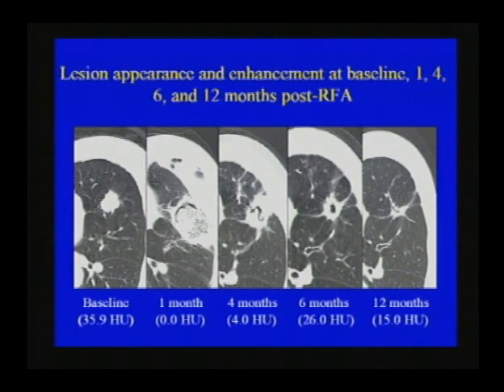I have to tell you that the very first case we did, we scanned the patient the very next day. And I have to recommend very strongly that you never do that. Because if you do that, what you will see is a complete whiteout of the lung, huge collections, and you will be tempted to do as I did, feeling that I had misled my then junior colleague, now very much my equal colleague, in getting him to do RF ablation, and that he had led me up the garden path because this patient would never recover. There were huge collections and diffuse whiteout.